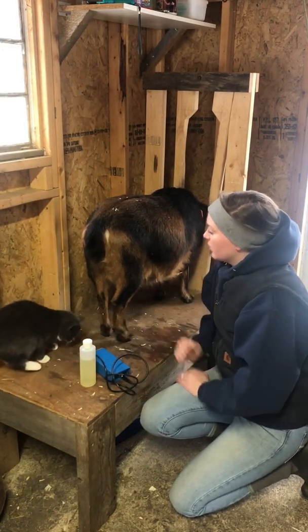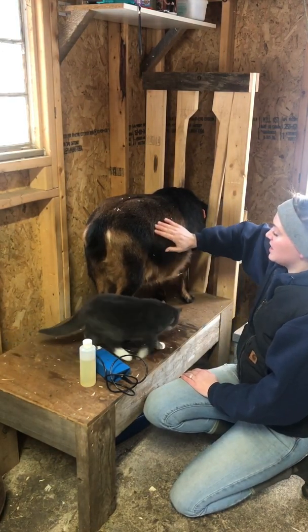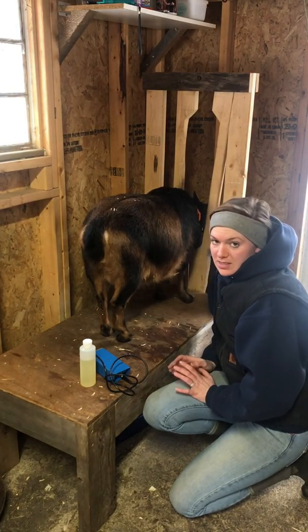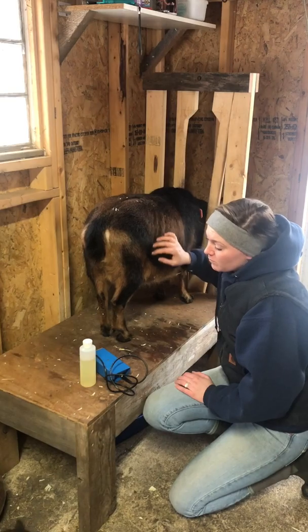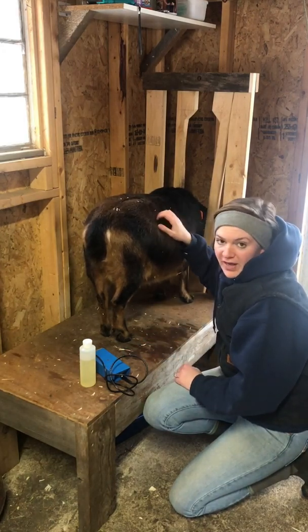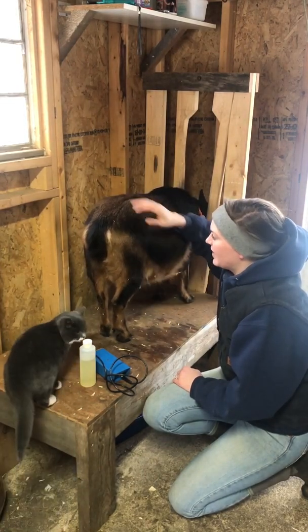Audrey was bred at the beginning of November and she is at this point nine weeks post-breeding. You can already see that she is pretty early starting to develop a nice little baby bump. It is still early enough that the PregTone is still effective. You can start testing with goats 30 to 40 days post-breeding — that's the sweet spot where you'll start to see some amniotic fluid development for the ultrasound to detect. Before that there isn't enough, and when you get really late in their gestation cycle, babies are really filling up the uterus and there's not a whole lot of fluid left to detect.